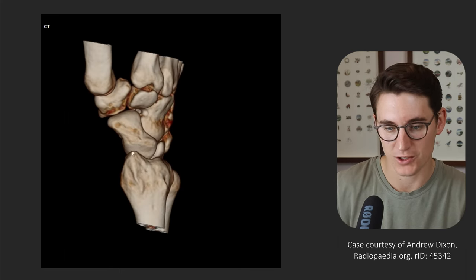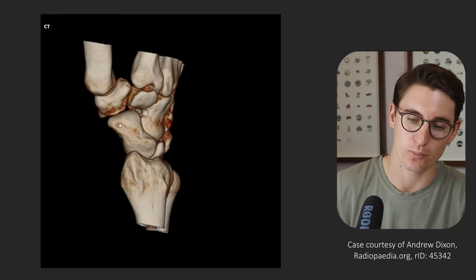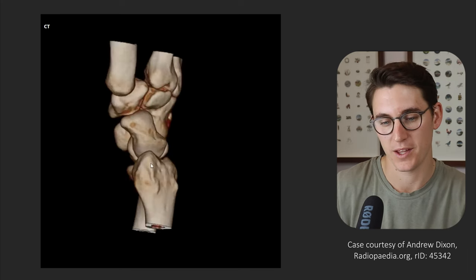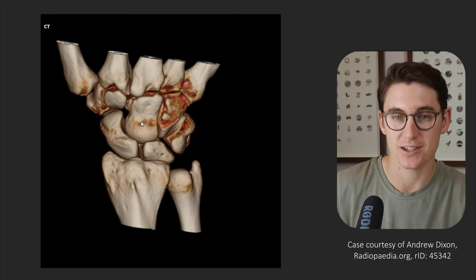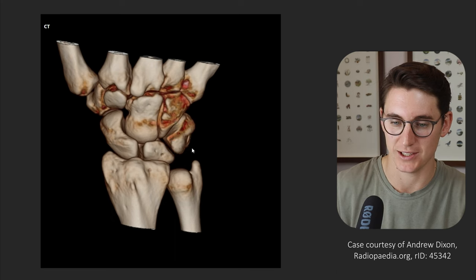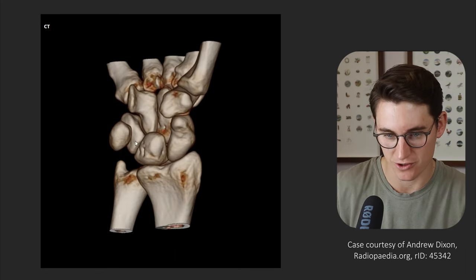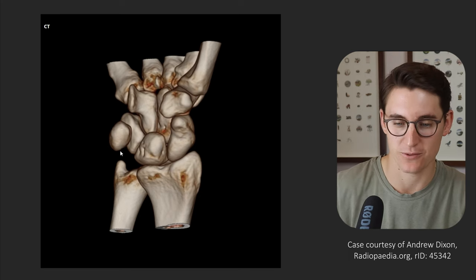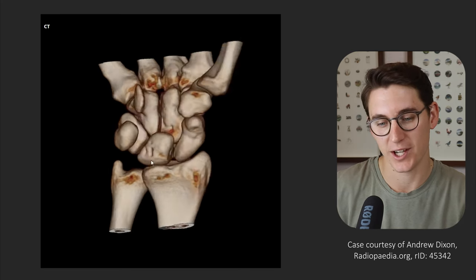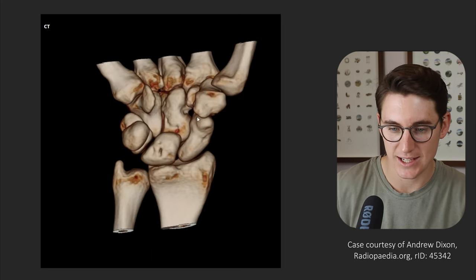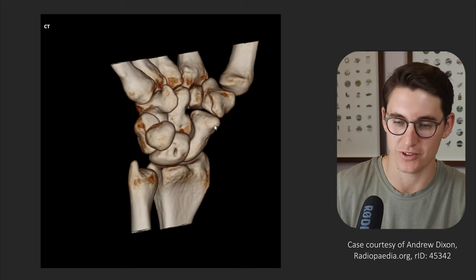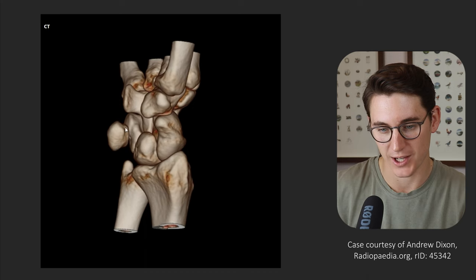We can see the scaphoid runs from posterior to anterior as we go from proximal to distal. We have a distal pole of the scaphoid, a waist, and then a proximal pole. Our lunate caps the capitate — the large bone in the middle of the wrist — and our lunate articulates with our triquetrum medially. In front of the triquetrum is a sesamoid bone, which is our pisiform bone. So the proximal row of carpal bones is made up of our scaphoid, lunate, triquetrum, and pisiform. The scaphoid tubercle and pisiform lie more anteriorly than the body of the scaphoid, lunate, and triquetrum.